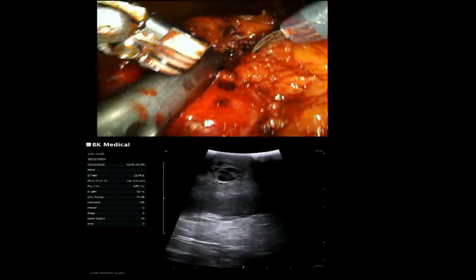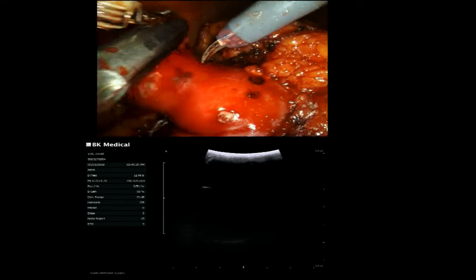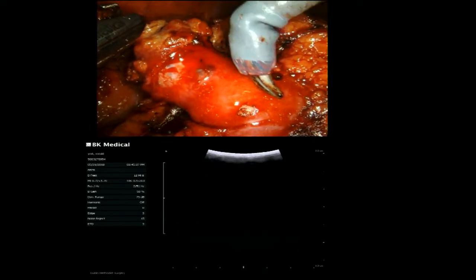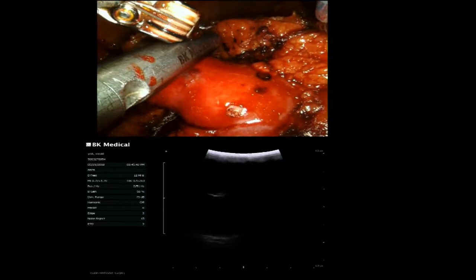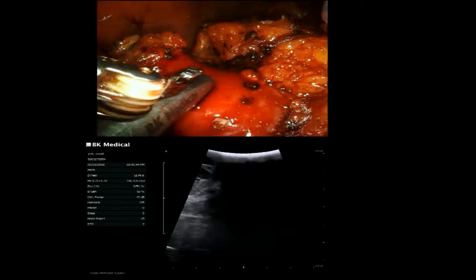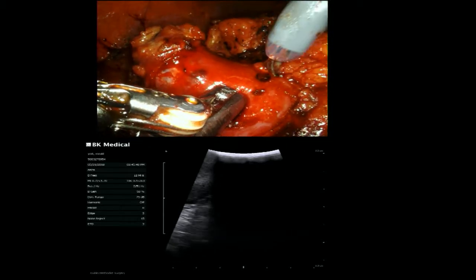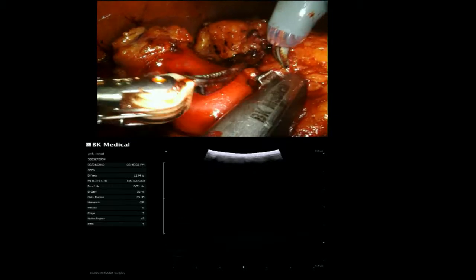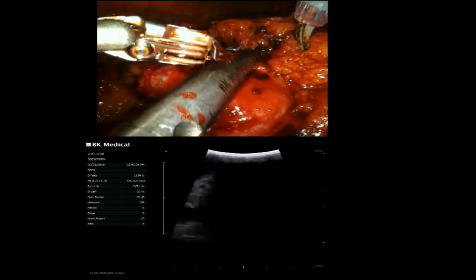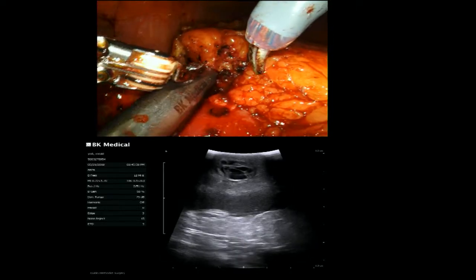All right, so here's what I'm seeing here. This is important. What I'm seeing here is that the tumor, the egg-shaped tumor, is not coming this way. It's actually going up that way. I'll show you here. So here we see the tumor's here. Now when we come down here, you see the tumor ends. There's no tumor down here. So the tumor's actually not coming this way at all. But when we come up here to the top edge of the tumor, we're still seeing tumor way up here. So this is tumor.